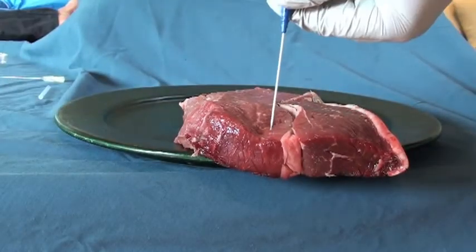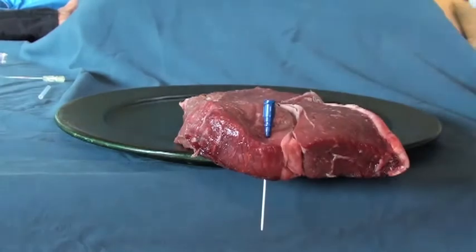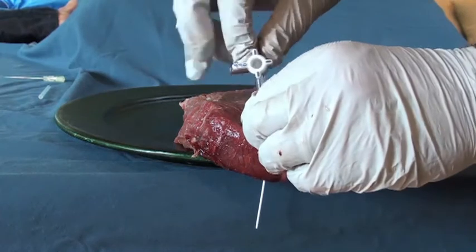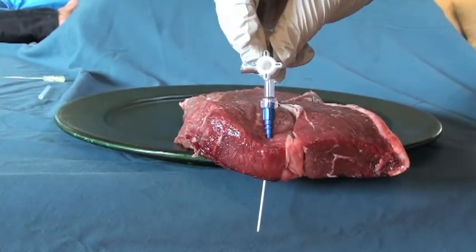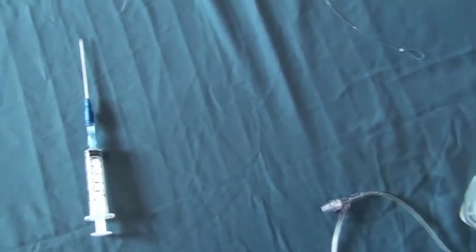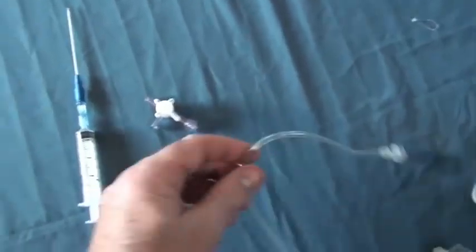The reason I like this method is it is fast — there, it's done. Of course, if you have a chest tube set up right there, that's best. But sometimes people crash quickly, and you've got to act quickly with what you have at the bedside right then and there. A central line kit has a long angiocath, a three-way stopcock — most of them do anyway — and a syringe for aspirating. And you know right where those kits are all the time.